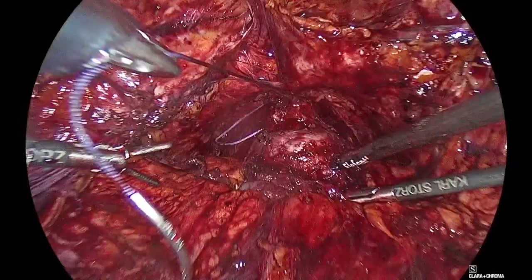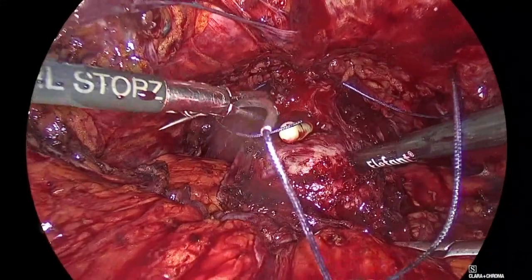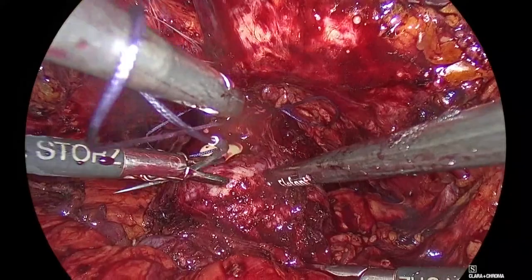Good. Do you want to say a word about the needle, Evangelos? It's slightly straightened. This is a slightly straightened needle. This is a CT1. We could go, as I said, with a smaller one also, but I kind of standardize this for all cases. One. Show me Padelis. Two. Show me Padelis to the right. To the right.